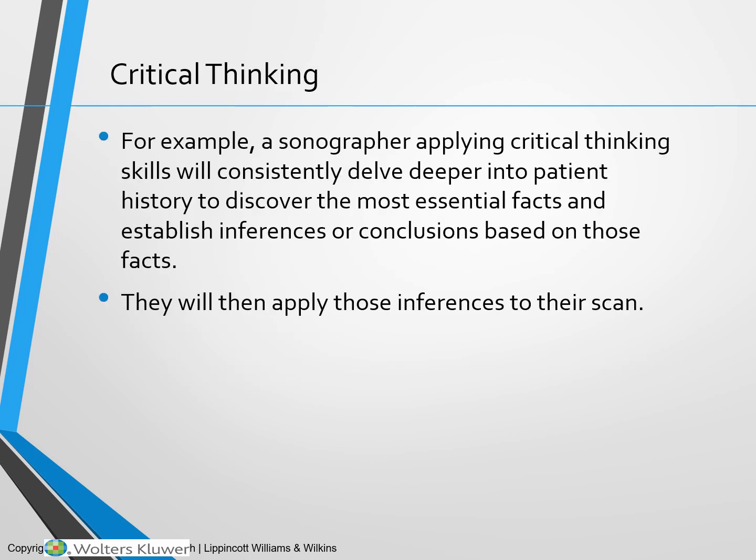Here's an example of how a sonographer would apply critical thinking skills. When taking a patient history, they may dive deep into those patient history questions to discover essential facts and then establish inferences or conclusions based on those facts. We are already making assumptions of what we may see or find on the ultrasound scan, and then we're able to apply those inferences to the scan.